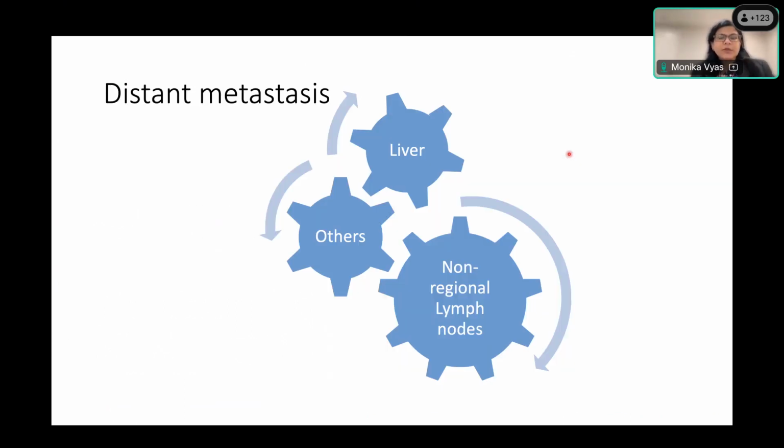And then distant metastasis, usually we don't have a way to comment on that. So we say not applicable unless you have a small piece of liver or a liver biopsy that's been done in the same sitting, and you can demonstrate that there is metastasis. Or if during surgery, the surgeon comes across non-regional lymph nodes which were enlarged and submits those to you, then you could definitely call it metastasis. But otherwise, in most of our specimens, it's hard to comment on distant metastasis.